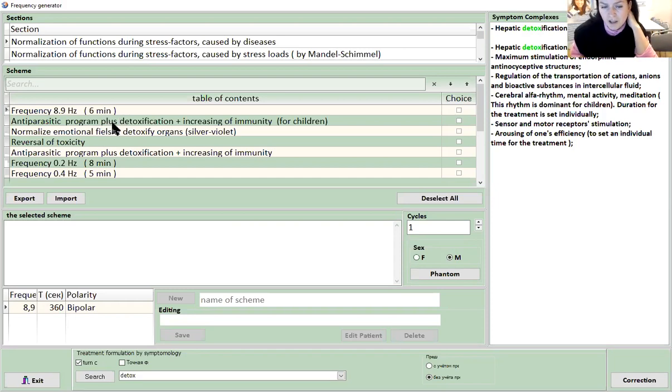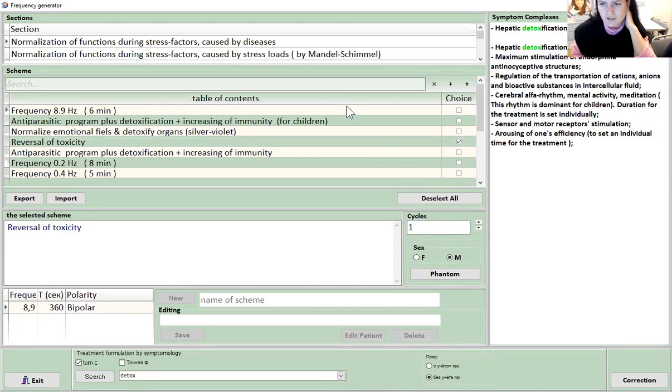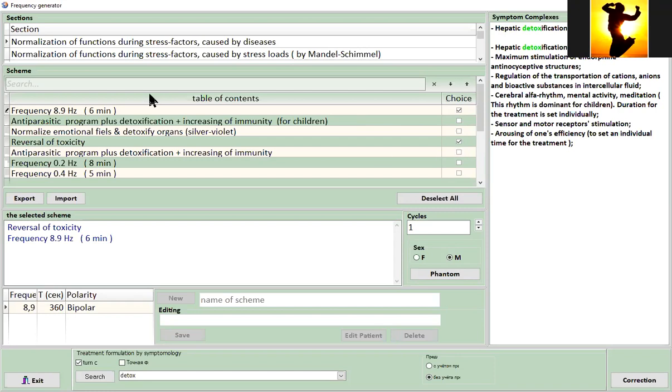But basically, if you see that person coming not for the first time, you can do heavy metal, you change, take this one, then you take the liver. For example, how do we know what the 8.9 hertz means? You checked it and said it was for liver, but how do we know that? Like frequency 0.2, how do we know what these are for? When you search for detox, it comes up as detox. It doesn't say detox liver, but when you clicked on 8.9, you said it was detox liver. How did you know that was specifically for the liver?